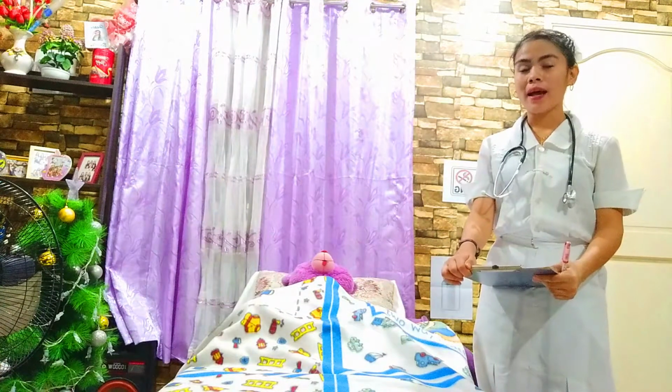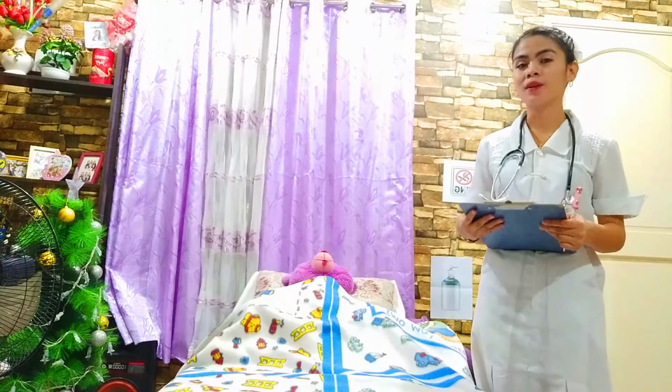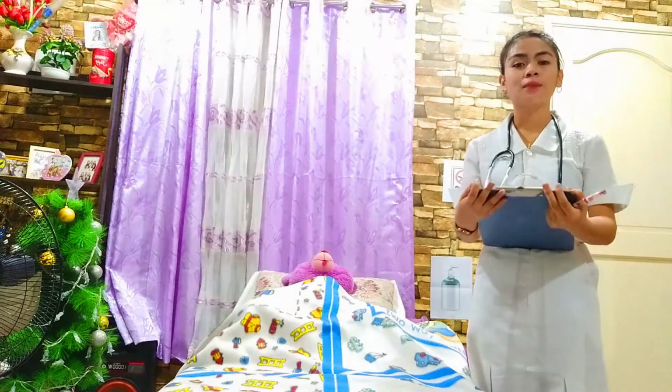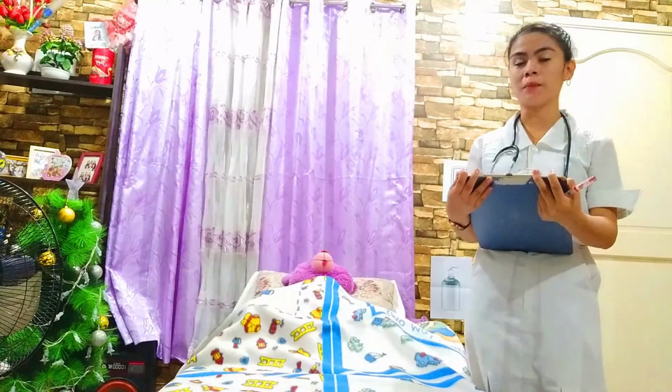Good day everyone, I'm Ian Grace Mayorga from Cavite State University main campus. I'm going to show you the return demonstration of administering oxygen via nasal cannula and simple oxygen mask.